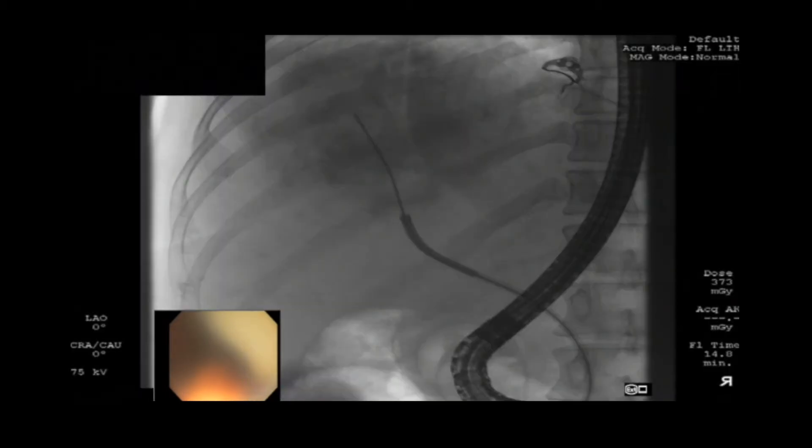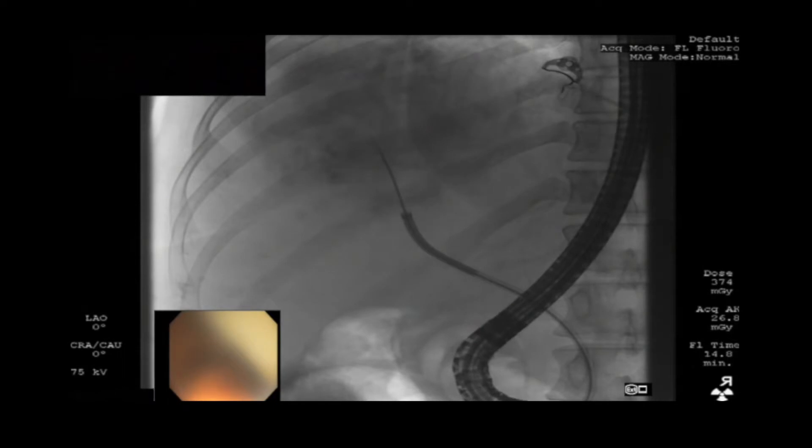Biopsy forceps were deployed through the cystobiliary fistula and into the echinococcal cyst to mechanically disrupt the cyst contents. Newly destroyed cyst contents, including hydatid sand, brood capsules, and membrane fragments, were suctioned through the cystobiliary fistula using the cholangioscope.